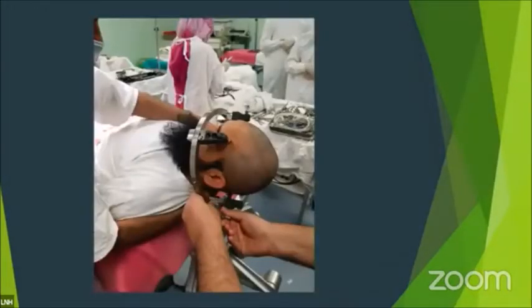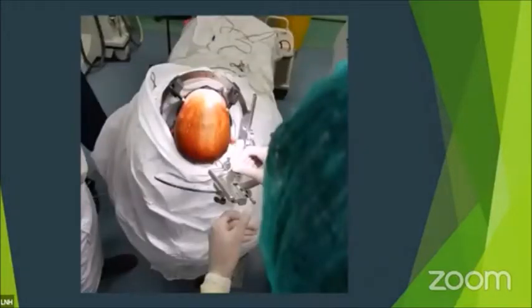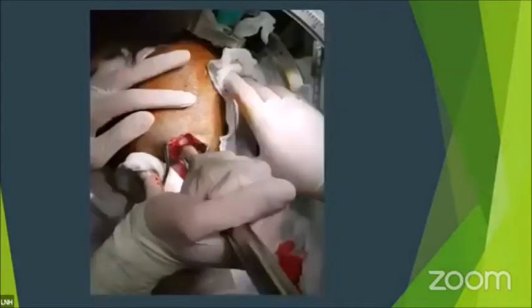So after this, the frame is removed. The head ring is set in place. The patient is set for biopsy. Since you have already calculated the lesion coordinates on the frame, the arc, you just remove it from the phantom frame, and this pre-calculated frame is mounted on the head ring of the patient. This lets you take the biopsy. One of the best features of the arc system is that you can manipulate your entry point since it's center based. You can change your entry point, but it will always point towards the lesion. A simple burr hole is placed and the biopsy is taken.